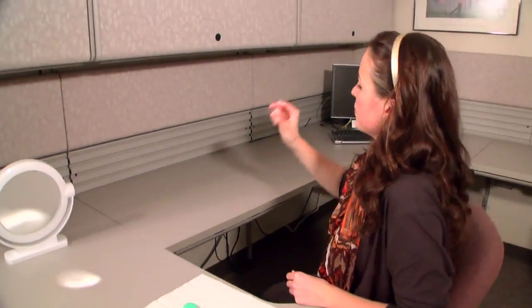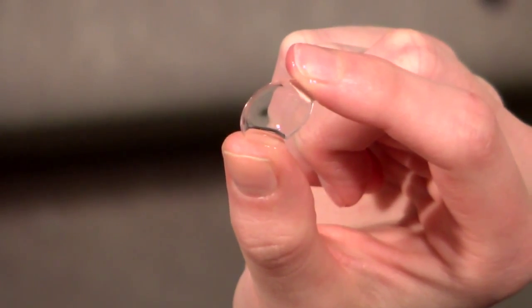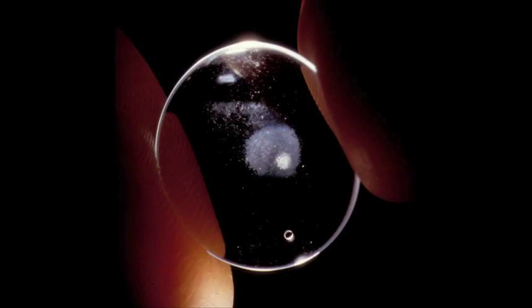Gently remove the right scleral contact lens from the case by sliding it carefully out. Inspect the lens to make certain there are no chips, cracks or debris on the surface. You can hold the lens up to the light to see if there are any deposits inside the lens bowl. Deposits may make the lens look white or cloudy.